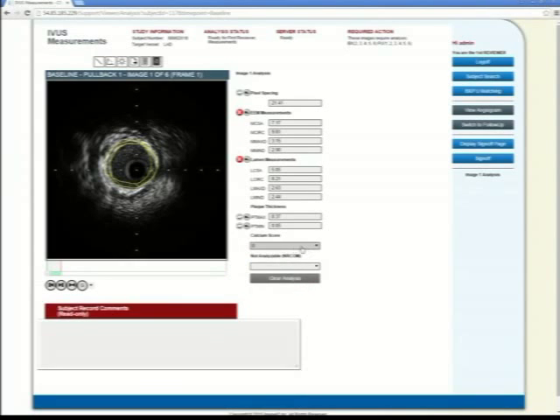And then we have a calcium score. It's not important what those values mean, but we also have that as an assessment. And then there's a non-analyzable field here. If the image was poor for whatever reason, a lot of calcium or whatever reason, we can provide that down here. But in this case, the image is fine. So when you say non-analyzable, that's because it passed QA. It passed QA as an exam, as the entire exam, but this single image may have a large branch site, or it may have a large piece of calcium that in an ultrasound shows shadowing, and so the tracing would not be accurate. So we throw those kinds of images out.